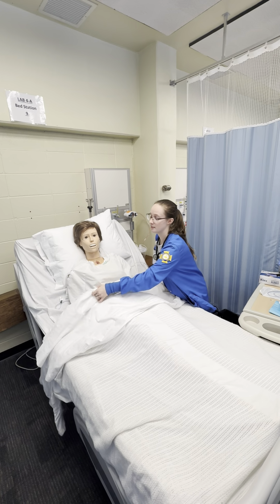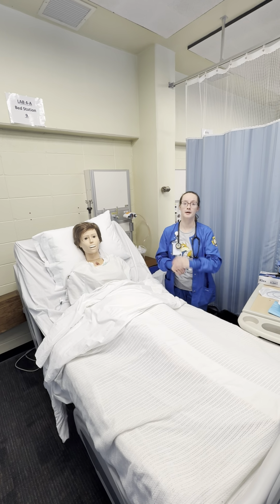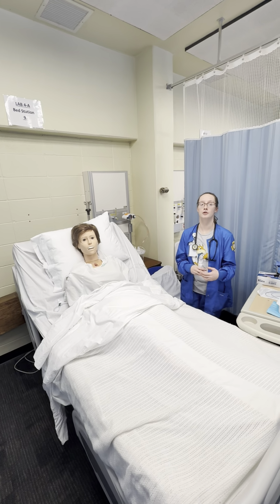So now I'm going to ask my patient to block one nostril at a time and to breathe, to determine which nostril has the best airway, and that's the nostril we'll be using. Today we've determined that the left nostril would be best for use. So then I'm going to go ahead and measure my tubing.